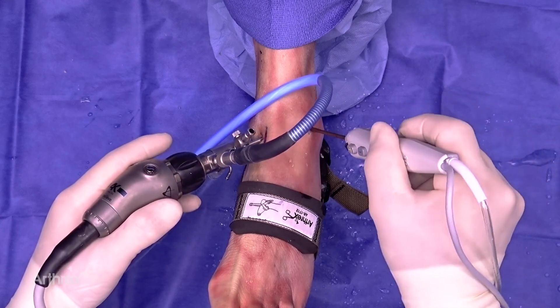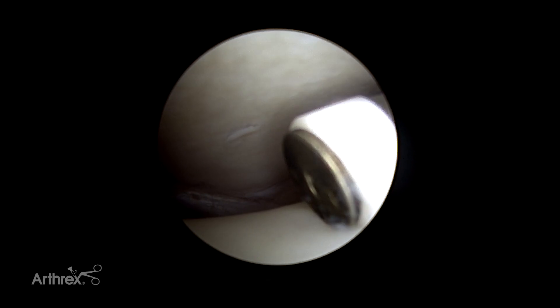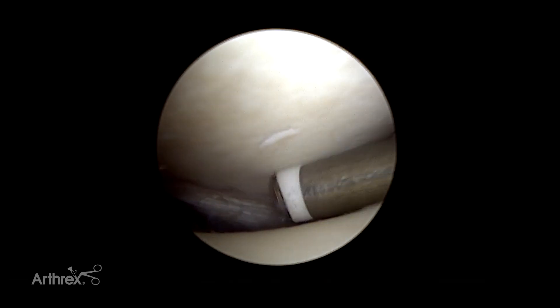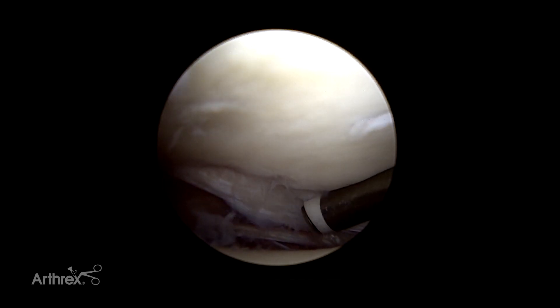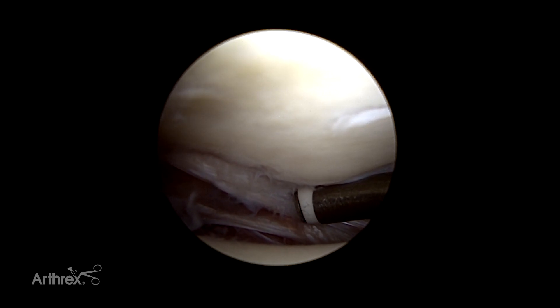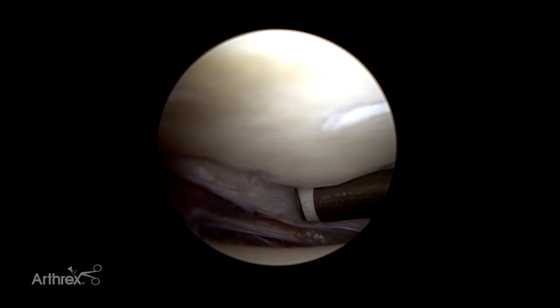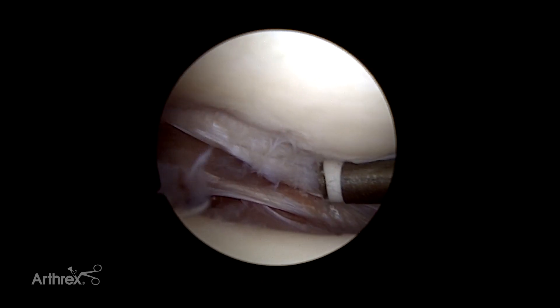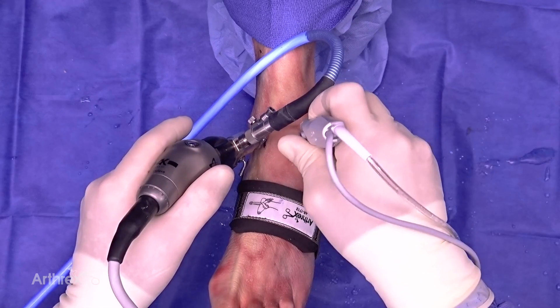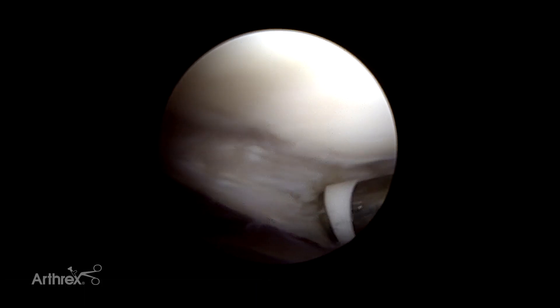The other beauty of this probe is that it has a 360-degree cutting edge on it, which is quite nice because you can actually use the edges just as much as the surface to do ablation. So if you wanted to take down one of the ligaments in the back, you can literally put it in there and hit — and you can see it's starting to cut using the edge of the probe.